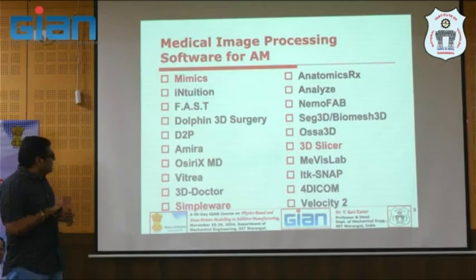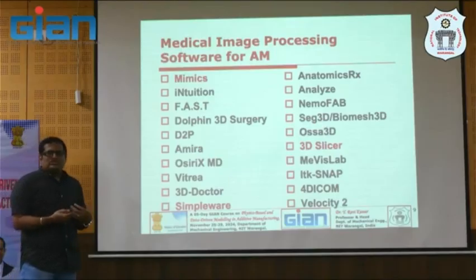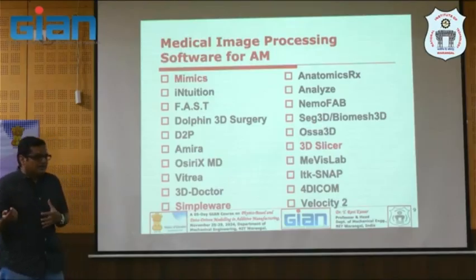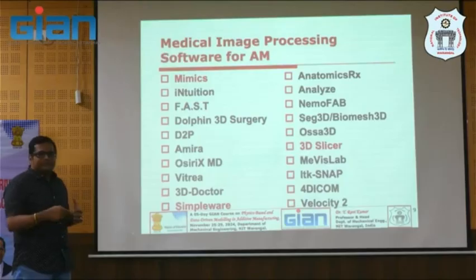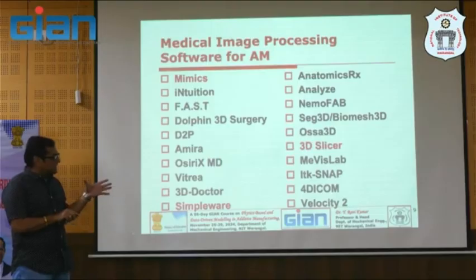But both of them are proprietary software. If you are looking for an open source software, this is 3D Slicer. It's free of cost, so it has almost all the features which a proprietary or commercial software will have. Basic tools like importing the DICOM images, applying thresholding and region grow, and saving as an STL file. All that can be done with open source software like 3D Slicer.